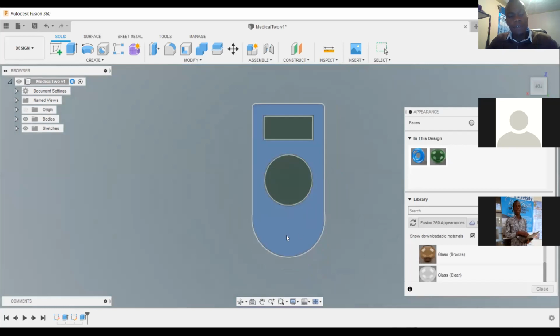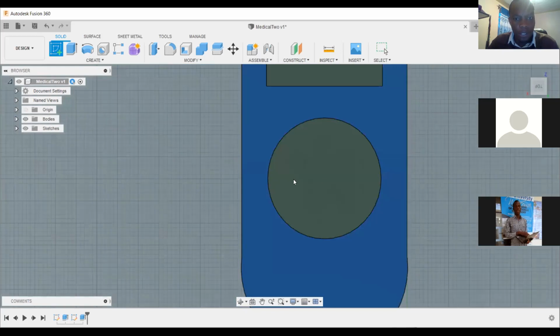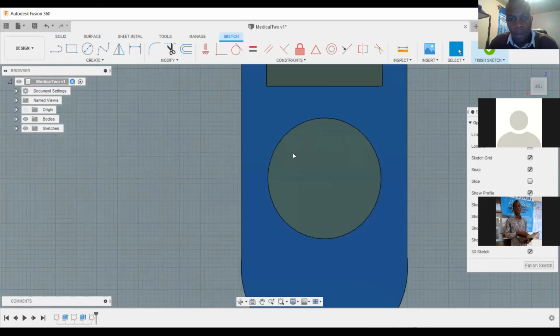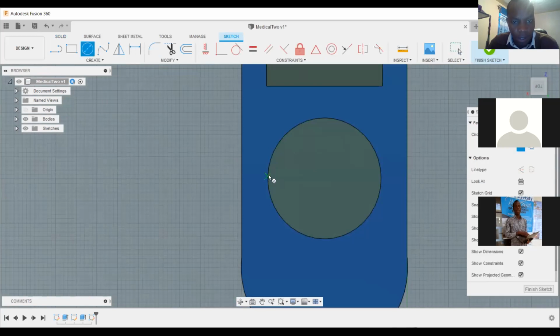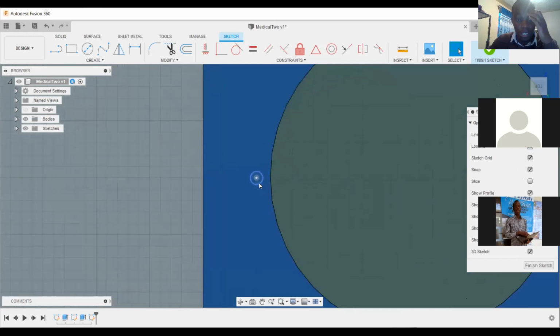Then we want to create something which is called a pattern. So come to sketch. Guys, are you following? Yes, so here I want you to create a small circle, very tiny circle like that. The dimensions don't matter now, but you get the idea. You create a circle here.